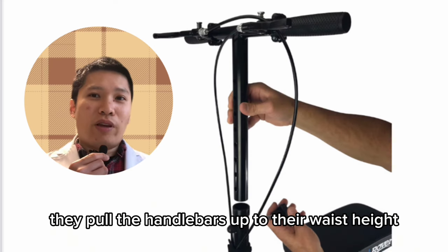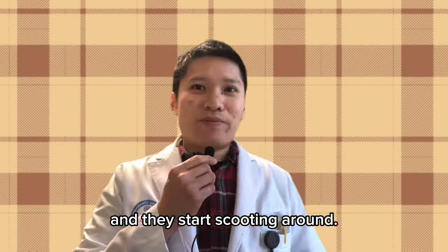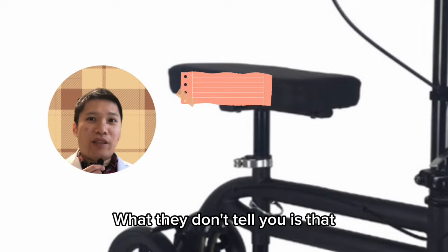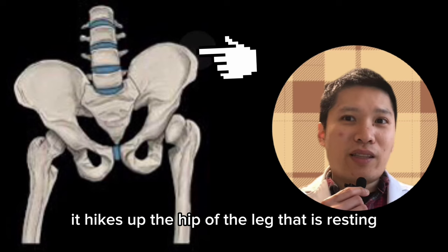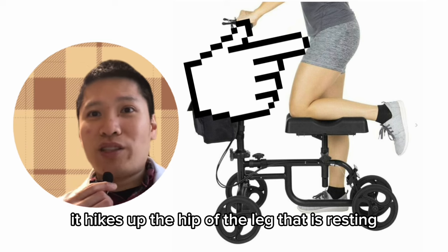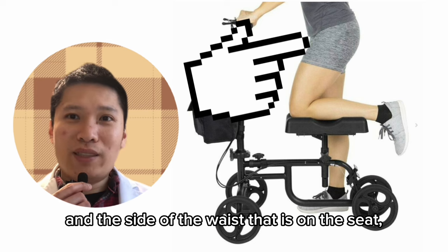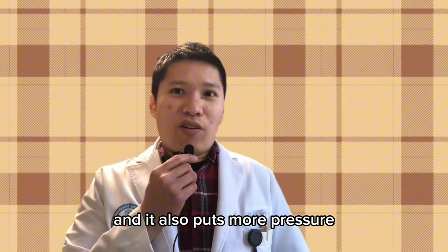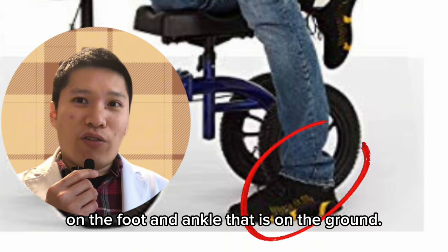So for most people, they pull the handlebars up to their waist height and they start scooting around. What they don't tell you is that if the knee scooter seat height is too high, it hikes up the hip of the leg that is resting on the seat. This puts more pressure on the hip and the side of the waist on the seat, and it also puts more pressure on the foot and ankle that is on the ground.